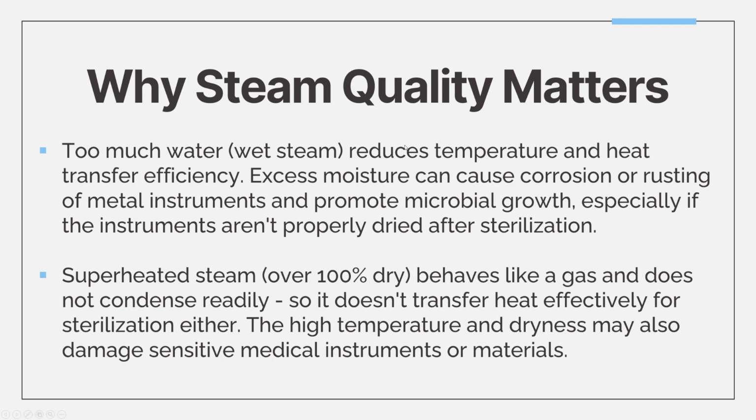So maintaining this high level of steam dryness ensures efficient heat transfer, optimal sterilization cycles, and protects the integrity of medical devices. In short, monitoring and maintaining an appropriate steam dryness fraction is essential for effective and reliable steam sterilization.